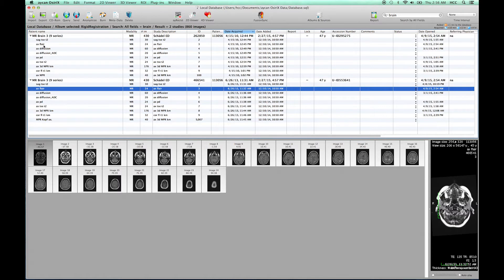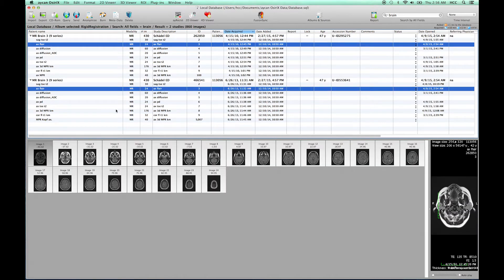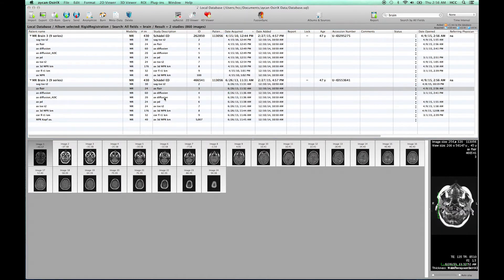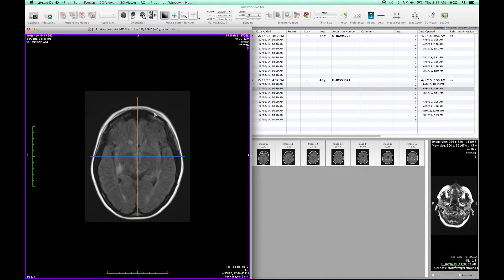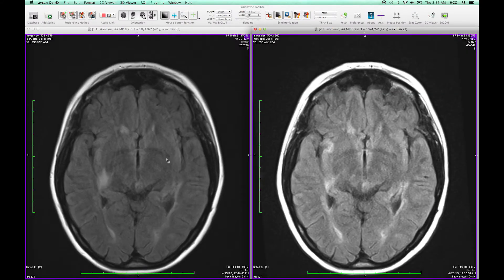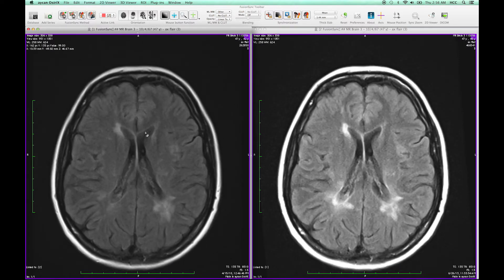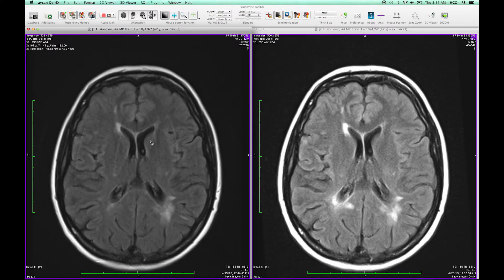First we make a selection of the images by holding the command key and clicking on the series. Then we press the FusionSync button in the database browser toolbar. The datasets will be loaded into MPR views and FusionSync tries to establish a spatial correspondence between the images. What you'll notice right away is that the images are already aligned properly, which is due to our automatic registration that was performed upon the starting of FusionSync.